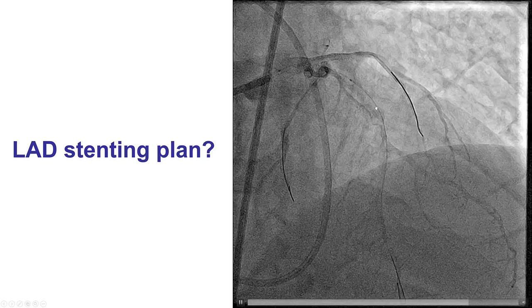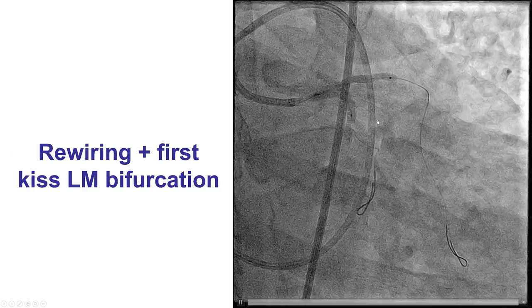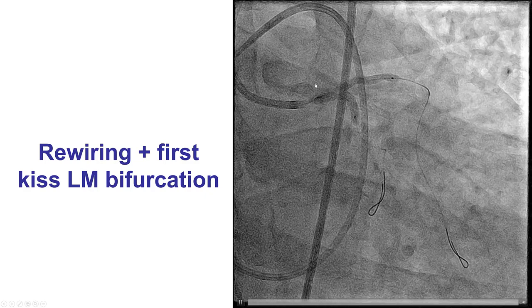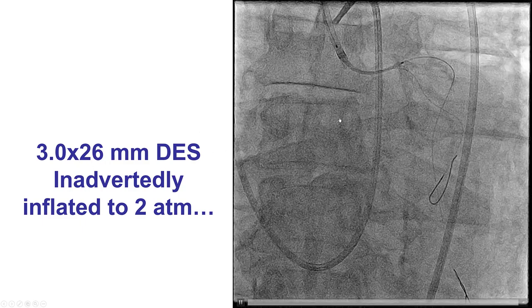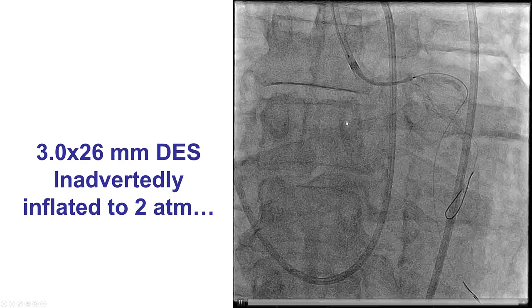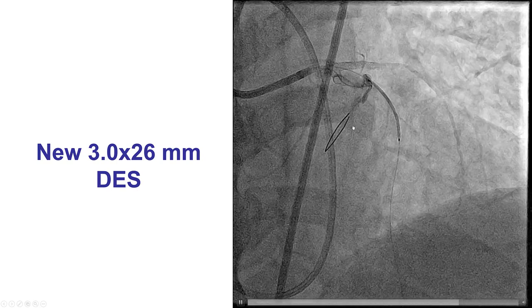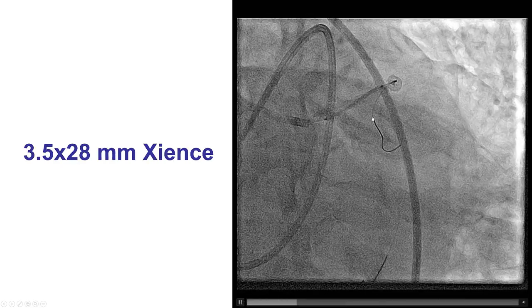We then decided to stent the LAD. It was a fairly long stent because there was significant disease going all the way close to the mid-LAD. We rewired for the first kissing balloon inflation and tried to deliver a 3.0×26 mm drug-eluting stent, but the balloon of the stent was slightly inflated upon connection — the stent looked much fatter than expected. Fortunately, this came out and we used a new drug-eluting stent to stent the proximal LAD lesion.